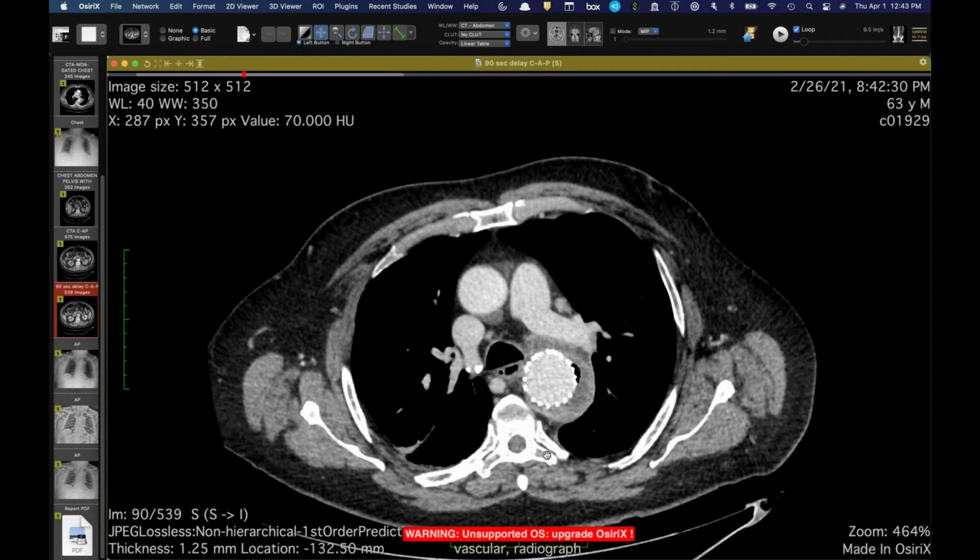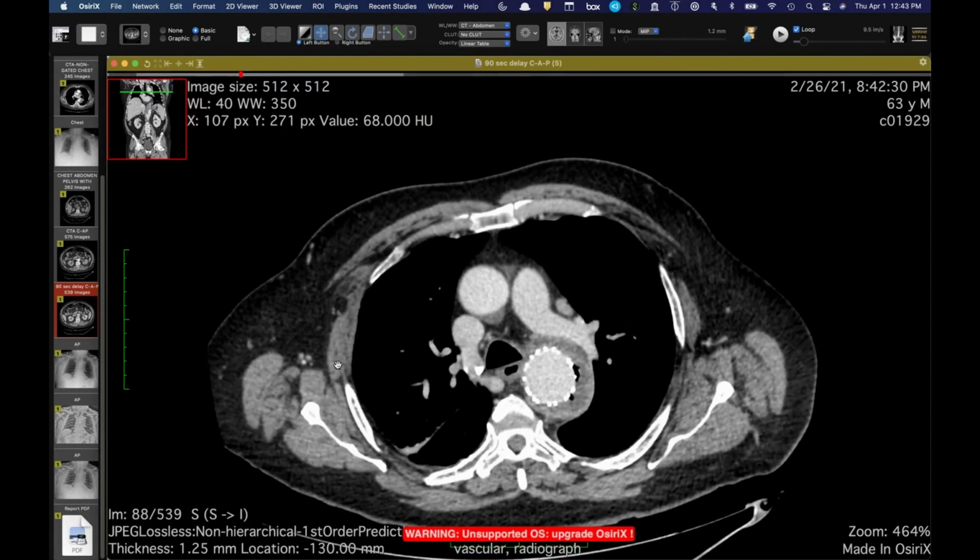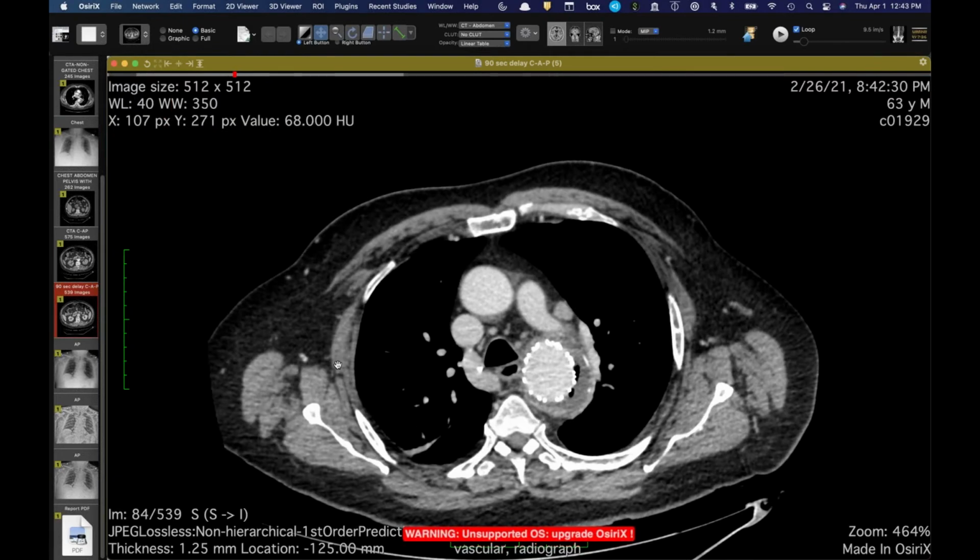Water soluble, right? You wouldn't want to leave barium sitting around. Correct. Yeah, and it's exquisitely sensitive with the water soluble, so you can use Omnipaque. We use Omnipaque 350, 50 mLs diluted in about 800 mLs of water, and then we make them drink at least 300 mLs.